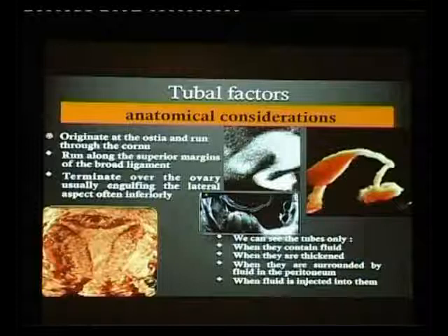Apart from the volume and the thickness, we must look at the endometrial peristalsis, and then we know whether this endometrium is right to transport the sperms and the ova. Then we need to check the endometrial vascularity. We can take a power Doppler, we can do the VOCAL, and the machine will tell us the vascularity of the endometrium in these cases.